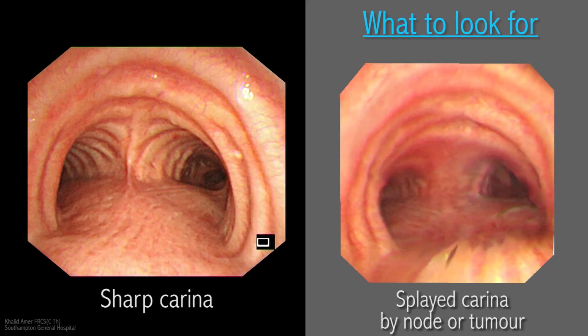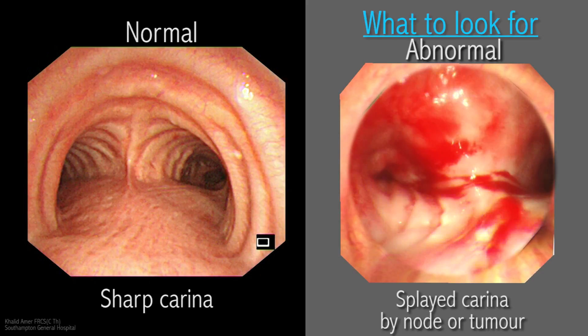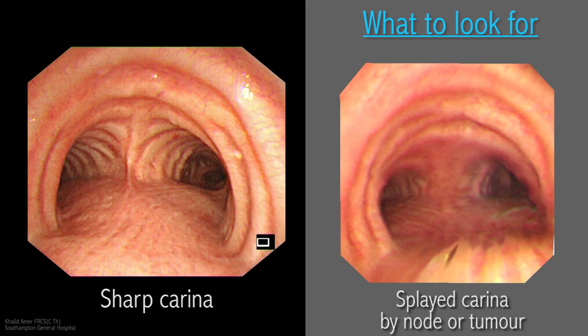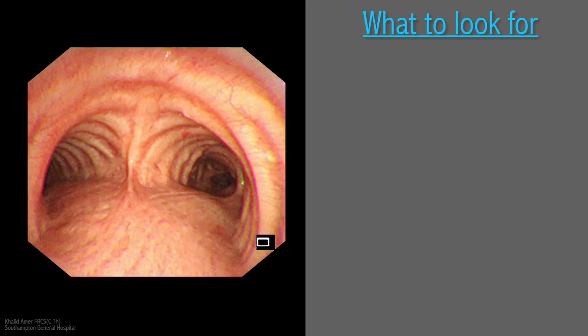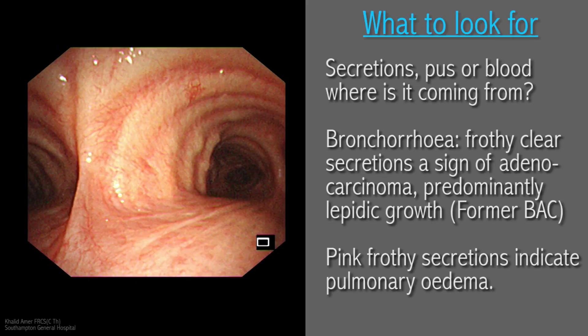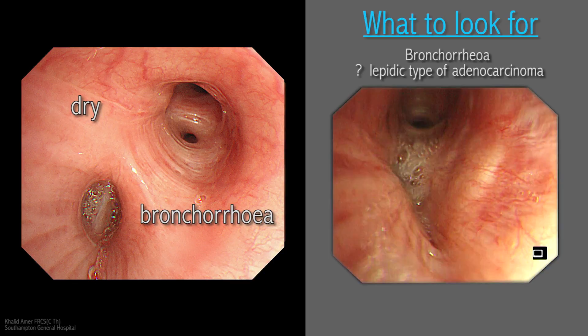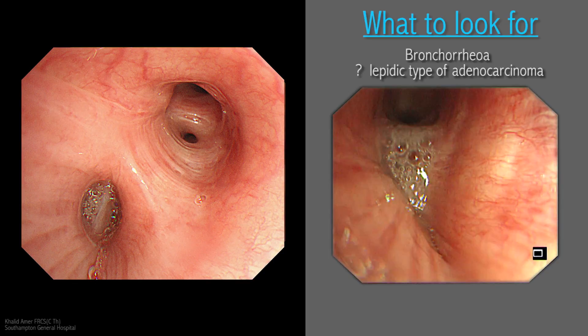The primary carina C1 is usually very sharp, in contrast to a splayed or widened carina. A splayed carina signifies underlying enlarged subcarinal lymph nodes in station 7, or malignant expanding bronchial or oesophageal tumour directly splaying the carina. General assessment of the airway is important and can predict postoperative complications. The operator should take note of secretions, pus, or blood in the airways and note the anatomical site of origin. Excessive clear frothy secretions are called bronchorrhoea and signify the presence of adenocarcinoma, lipidic type, previously known as bronchiolo-alveolar carcinoma.